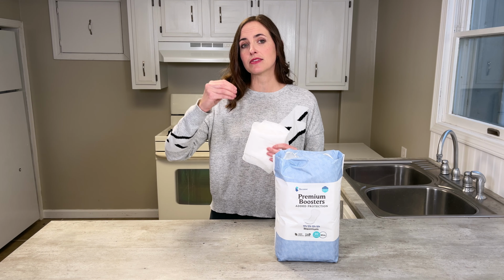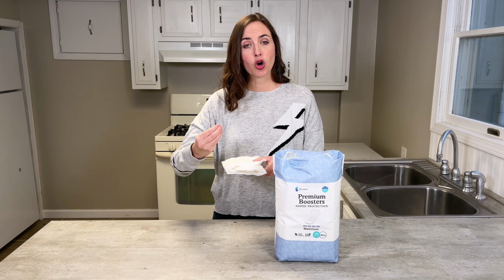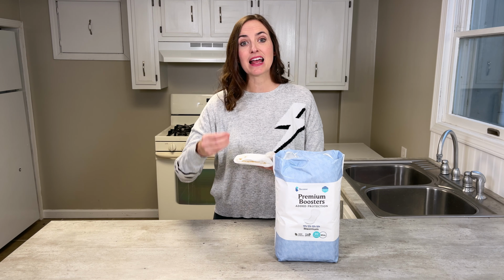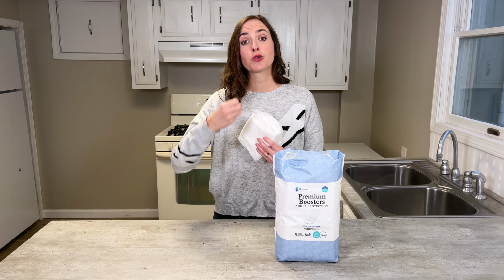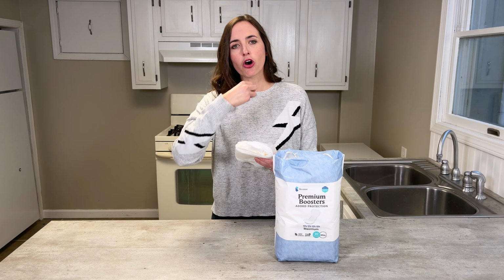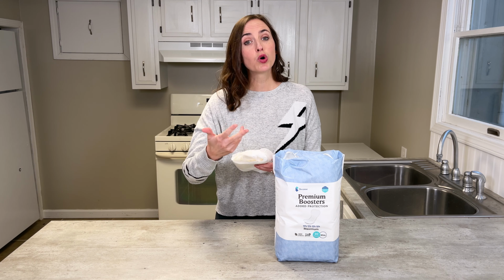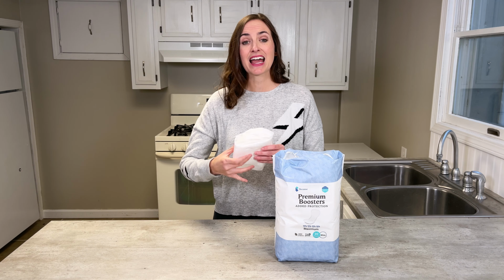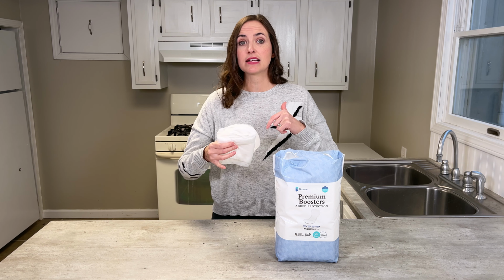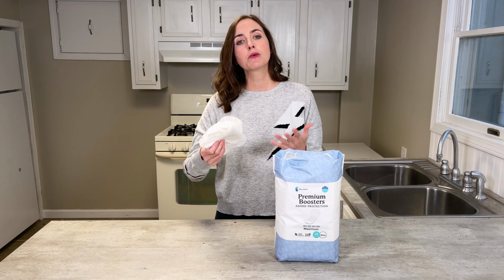And again, I said earlier that what this will do is absorb the liquid, take it into the core of it, leach it away from the body, and then eventually, if it starts to oversaturate, send it through to the other brief. By doing this, it's pulling all the moisture away from the skin. Super important if you're dealing with skin sensitivity or skin breakdown or, in even more severe situations, wounds. So if you have those types of things in play, adding a booster is a really good idea to prevent infection or bacteria growth. This can also improve independence.